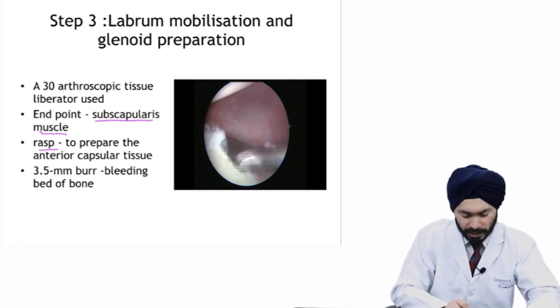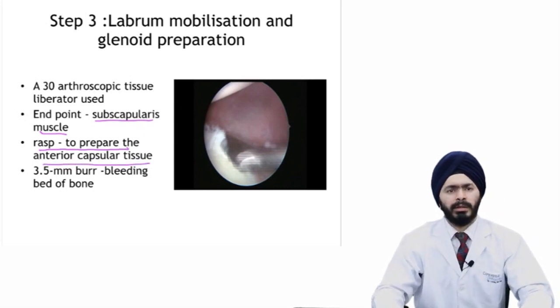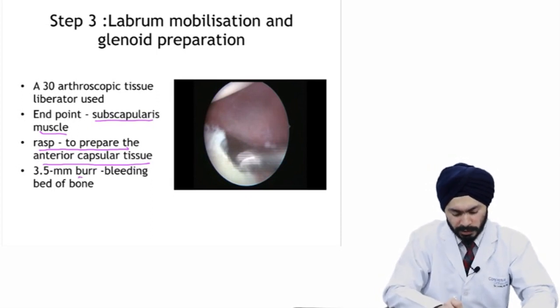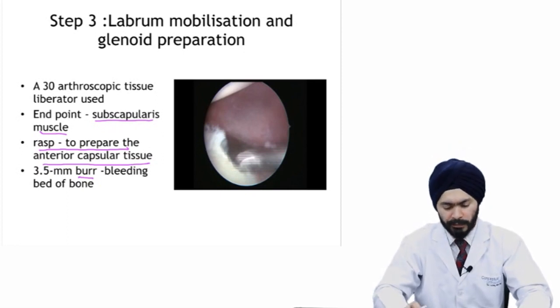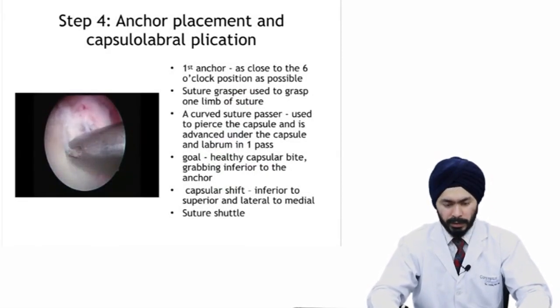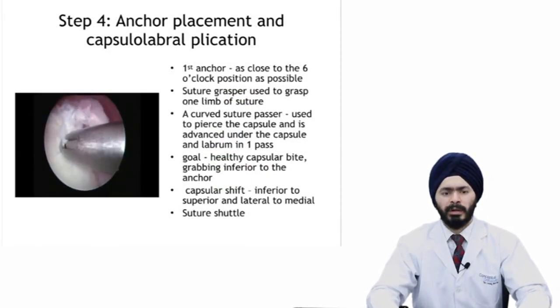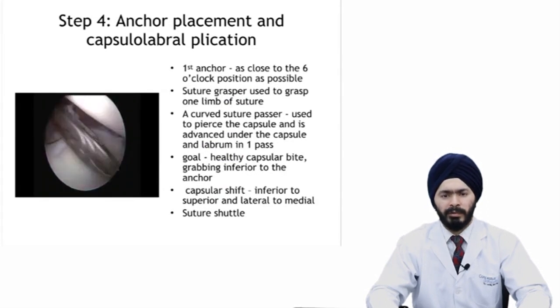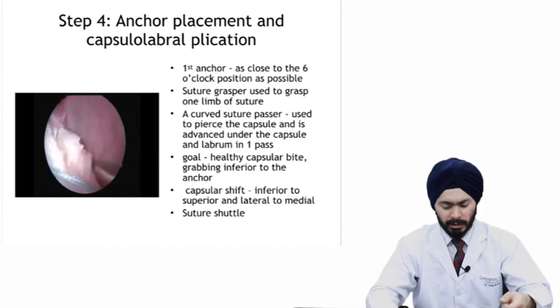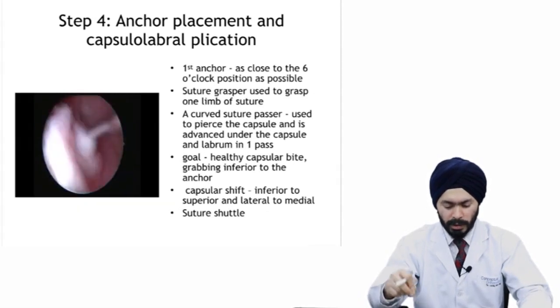After liberating the labrum, you take a rasp to prepare the anterior glenoid surface down to bleeding bone, because the labrum has to reattach and reunite here. Usually use a rasp or a burr to get a bleeding bone surface. After mobilizing your labrum, you move on to anchor placement. From the antero-inferior portal, you place the first anchor as low as possible — preferably around the 5:30 position.